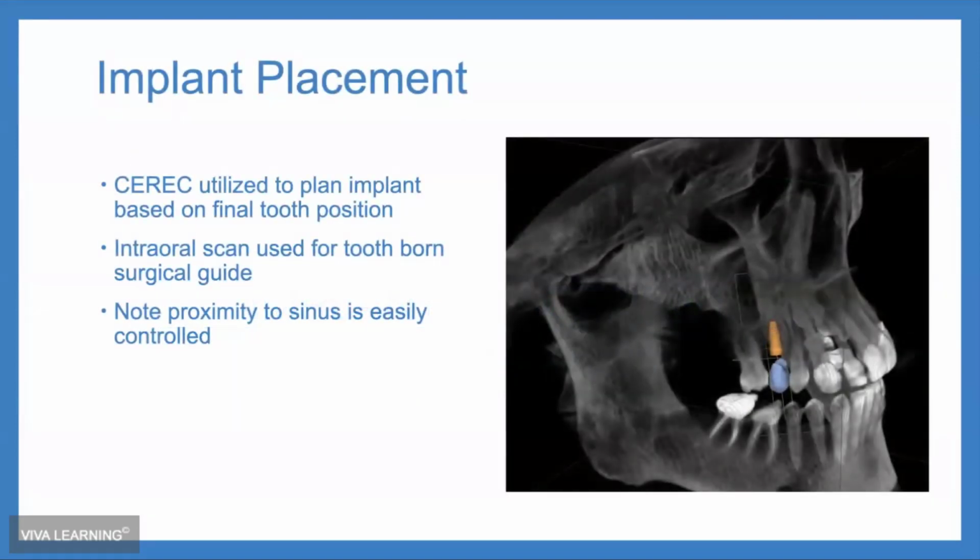So we're going to get into a little more advanced concepts now. That's all focused on soft tissue primarily, where we're either uncovering an implant or trying to improve the contour of the emergence profile when you remove a stock healing abutment. But now we're going to get into how we can apply this to our implant practice on the hard tissue side of things.